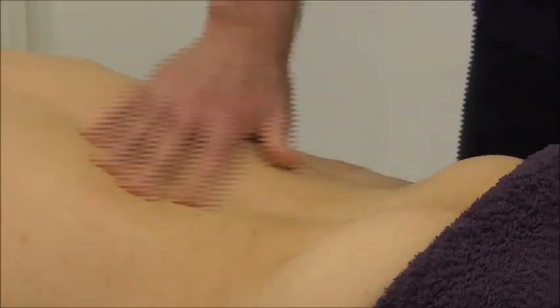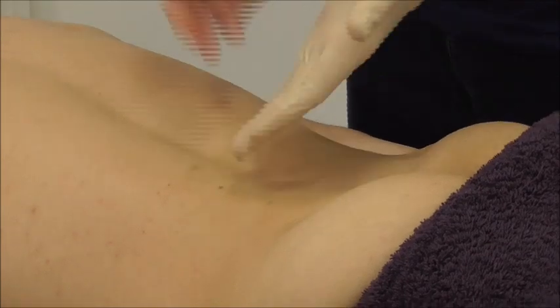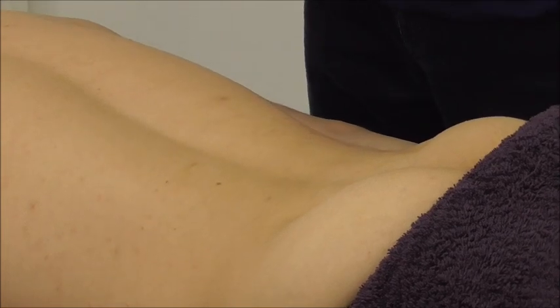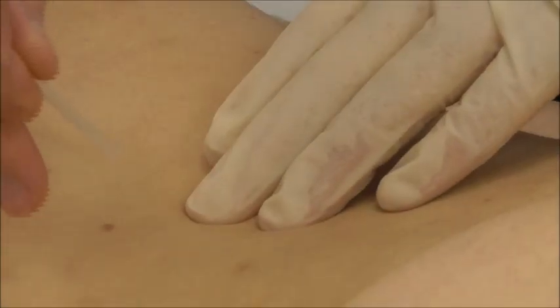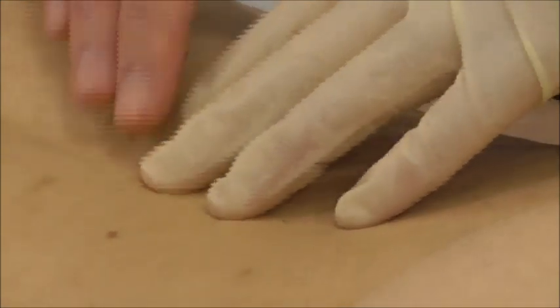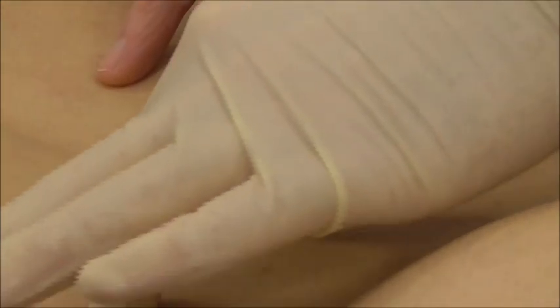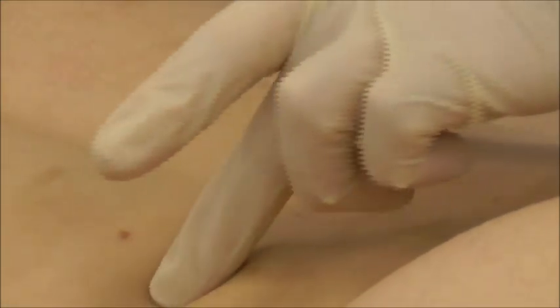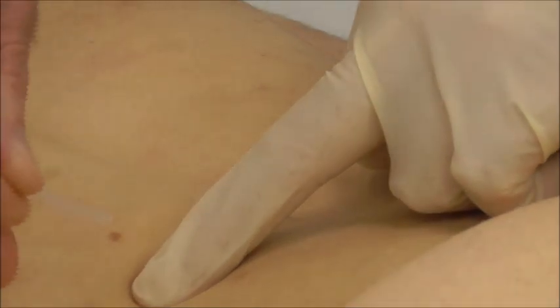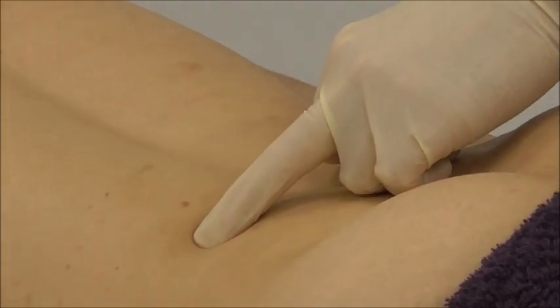We've got our hand sanitising gel. If someone has a very deep lordosis, you can place a bolster beneath the abdomen to flatten that out. With our needle, we can needle either away or towards the spine, but I tend to find the needle is more controlled coming towards yourself. The centre of the muscle is approximately two finger widths from the spine. The angle of the needle is important — we want to angle it in towards the spine.